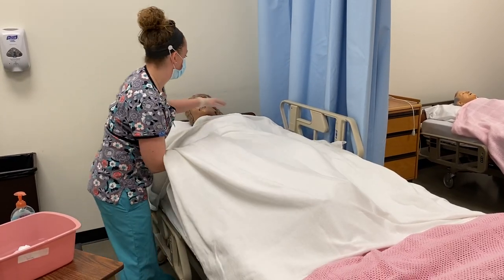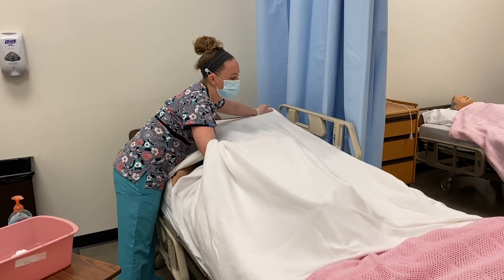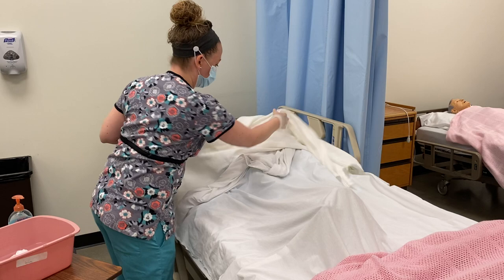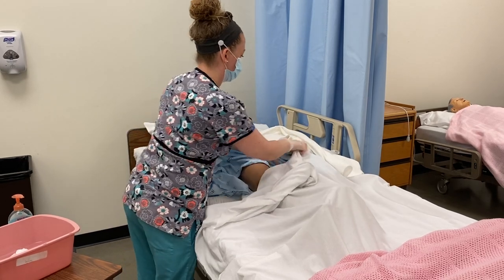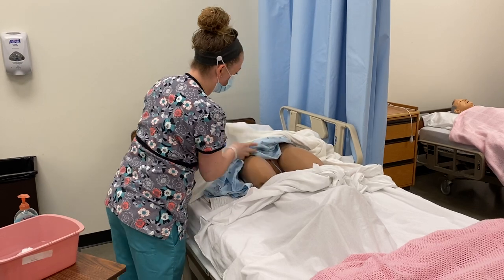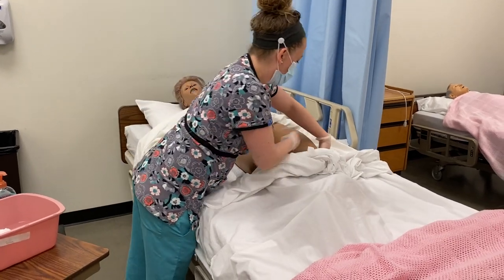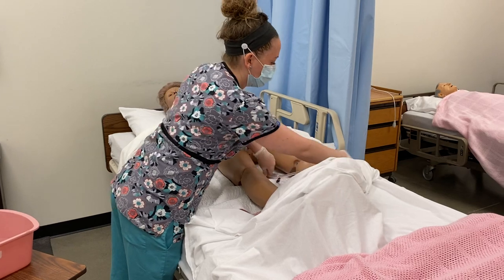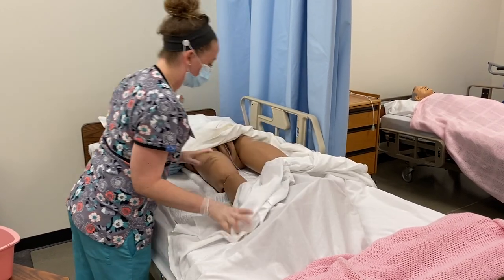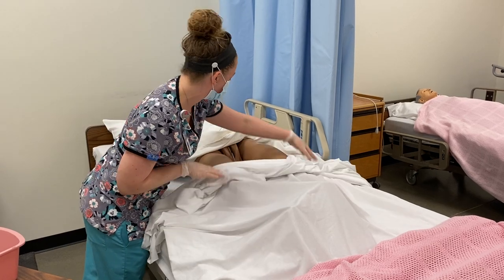I'll pull your sheet down but keep you covered, exposing just your peri area. I'm also checking to make sure the catheter is free of kinks and urine can flow freely through the tubing.